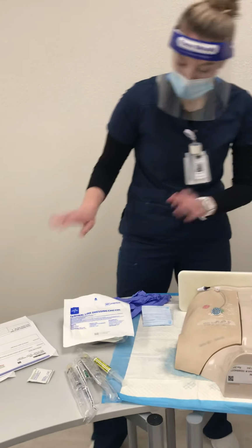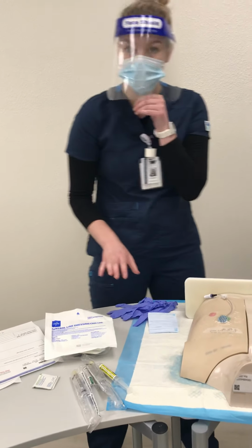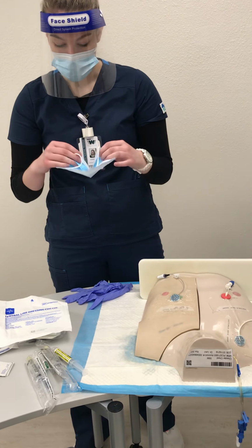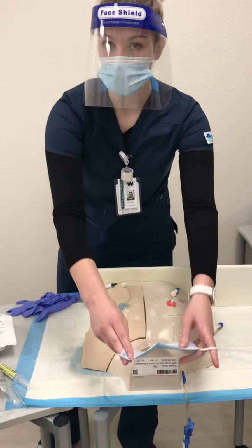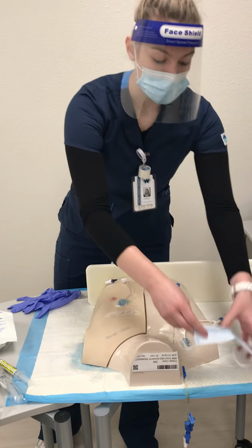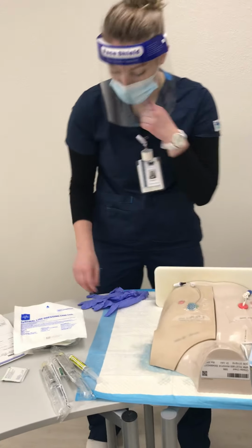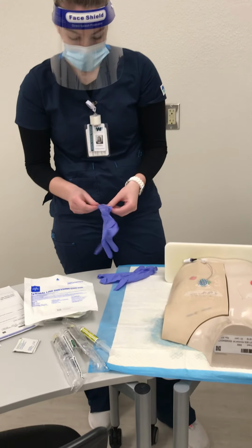Okay, so now we're going to pretend that this was never opened and that everything was in there already. And we're going to provide a mask for our patient. So we will put this on the patient. And then also just as an extra precaution, we're going to ask the patient to turn their head away from these sites. They're going to turn their head this way. And then I've done my hand hygiene and I can don gloves.